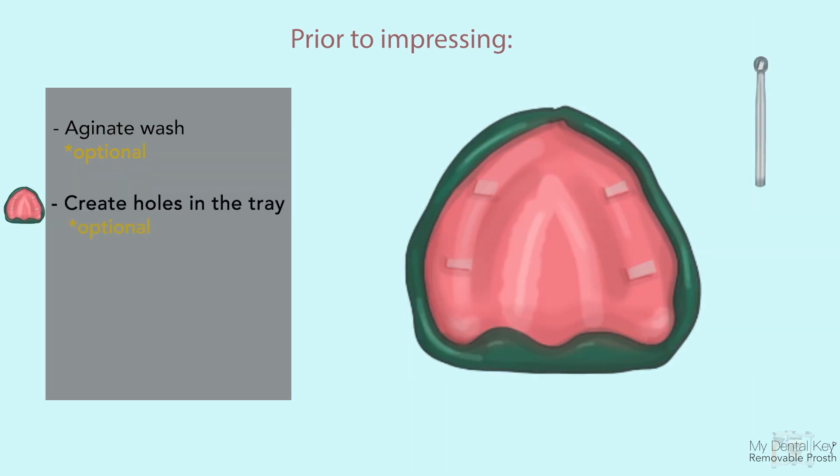Optionally, using a number six round burr or round acrylic burr, place two to three holes in the rugae area and mid-palate of the maxillary tray to reduce potential hydraulic pressure in subsequent steps.